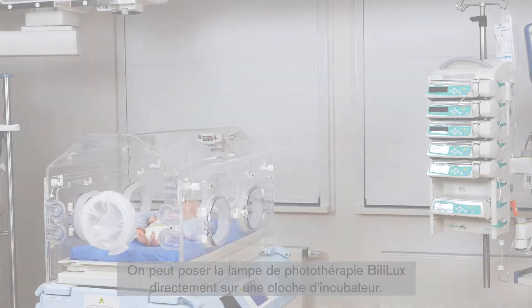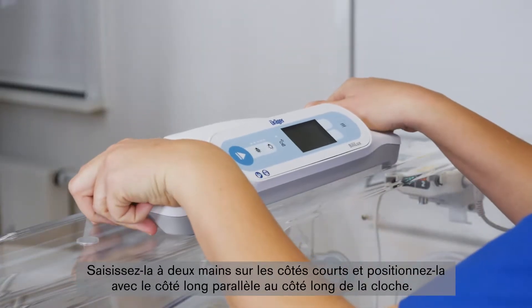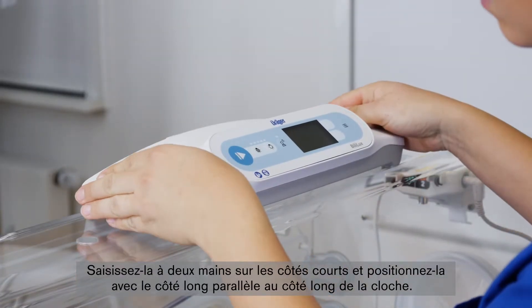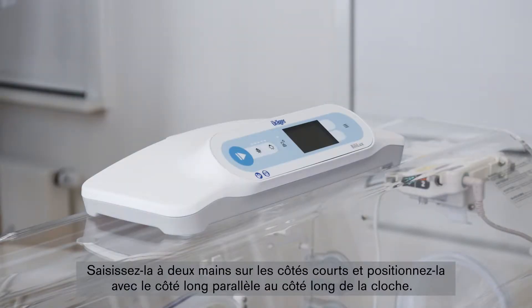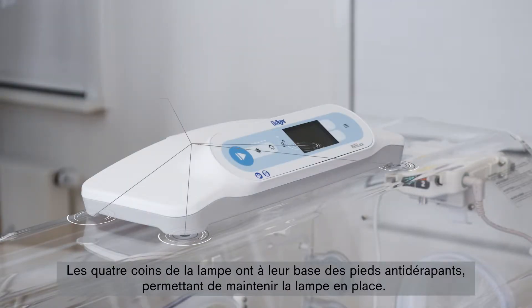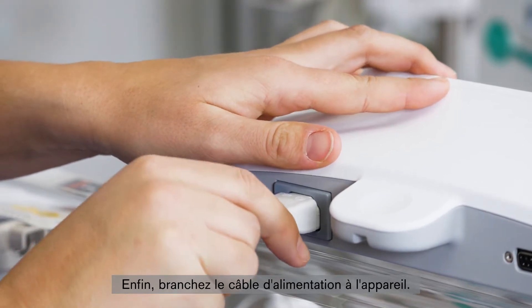The Bililux Phototherapy Light can be placed directly on an incubator hood. Grab it with two hands on the short sides and position the light with the long side parallel to the long side of the hood. The four corners of the light have slip-resistant feet on the bottom that help to keep the light in place. Finally, attach the power cord to the device.